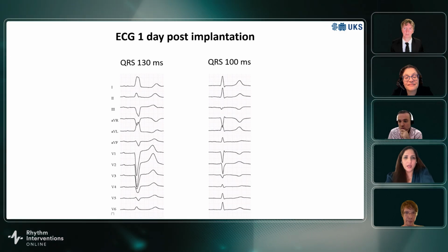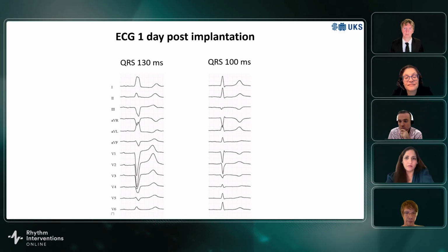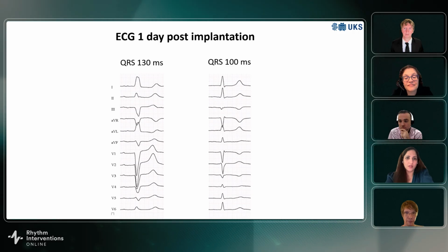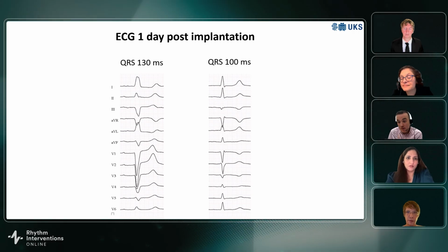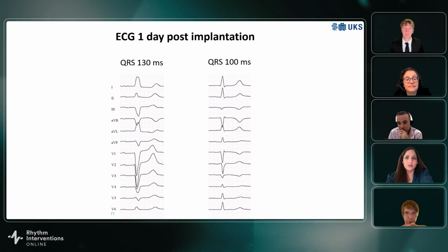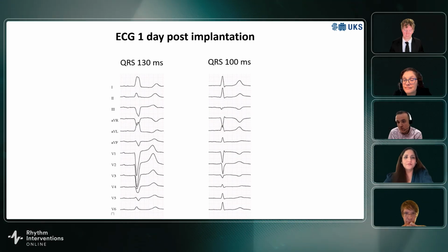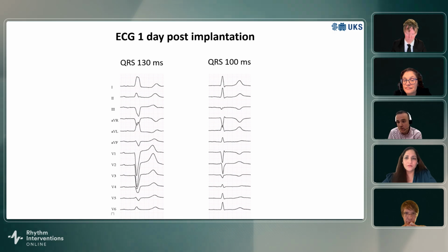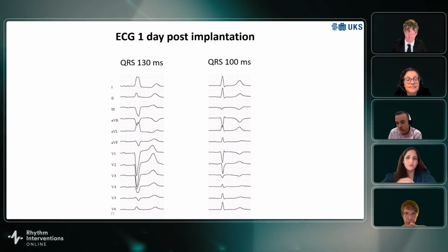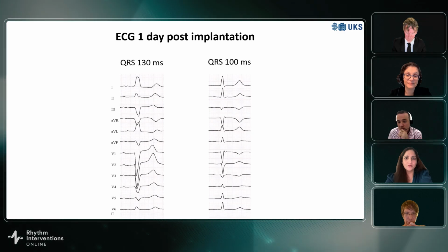I think Dr. Oscar Cano also came up with ECG criteria, which were recently published in JACC, whereby you can use that upstroke ratio. Yes, the upstroke: fast, then slow in some cases. I think what we had is fast, because we are stimulating the conduction system, and then slow. So that's the ECG after implantation.